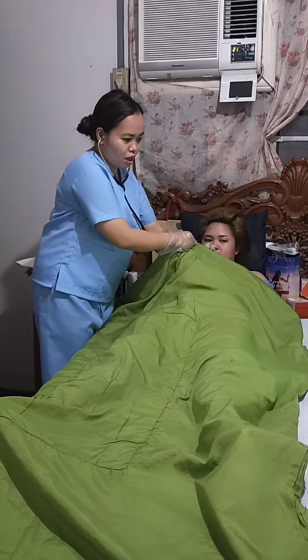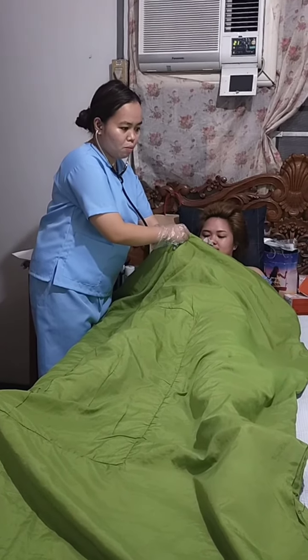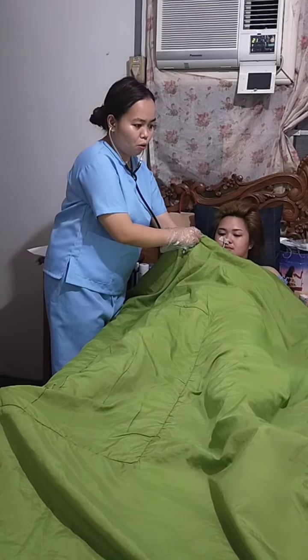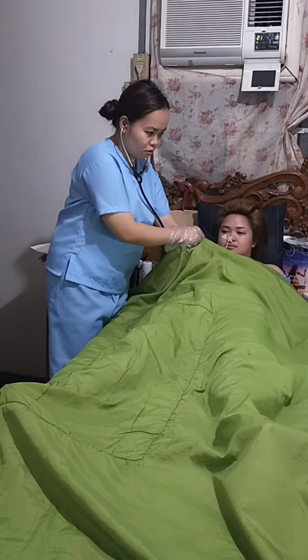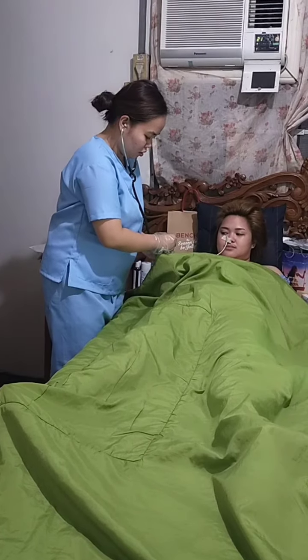While you listen with the stethoscope, auscultate approximately 3 inches or 8 centimeters below the sternum to obtain the proper placement of the tube. Now we're going to check using the stethoscope. If the tube is in the stomach, its contents can be aspirated, and you will be able to hear the air entering. If the tube is in the esophagus, injecting air will be difficult or impossible.